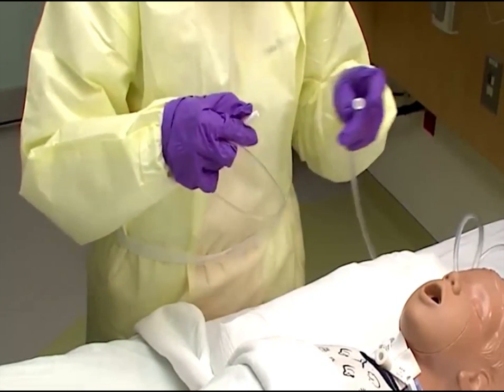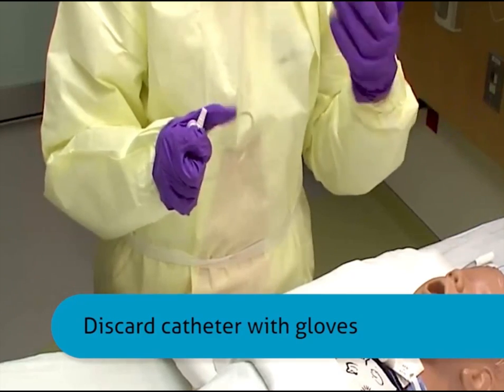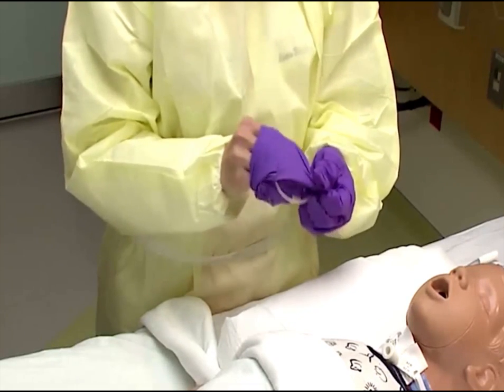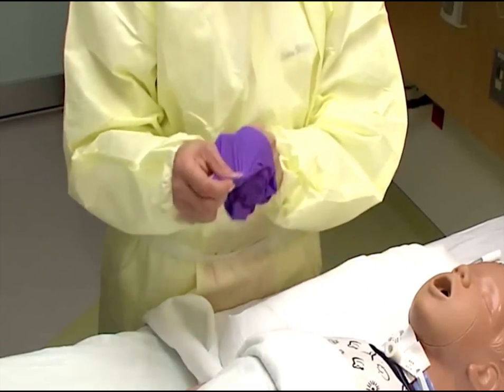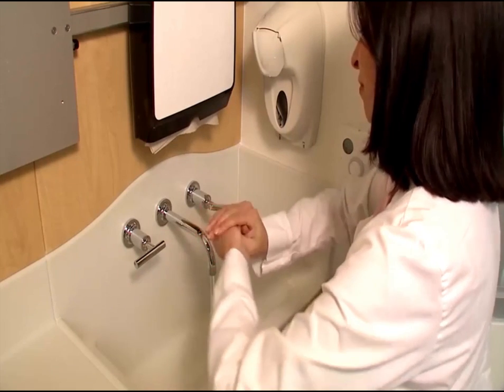Lastly, remove your gloves and discard with the catheter. If the child needs it, hyperinflate their lungs with 100% oxygen. Assess effectiveness of suctioning. If ventilatory difficulty or patient discomfort persists, repeat the suctioning procedure. You should always wash your hands after the procedure.